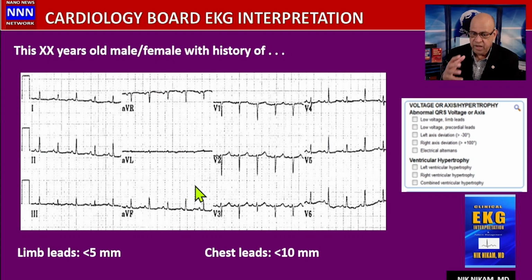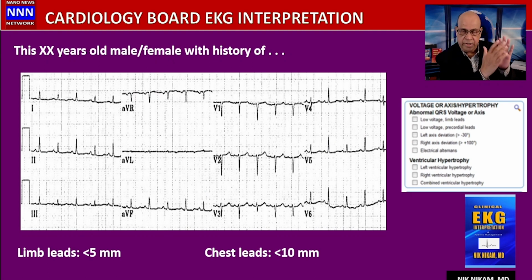See, the electrocardiogram is almost like being a detective as to where the heart has been, where the heart is here today, and where it could go in the coming days. Especially if you're dealing with an acute myocardial infarction, you can expect evolutionary changes as time evolves.